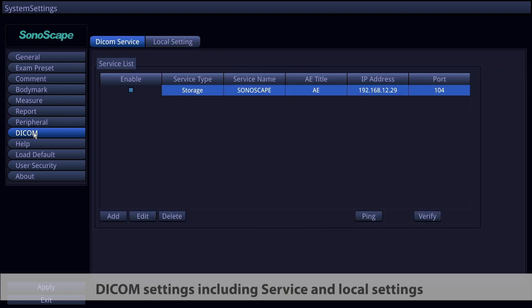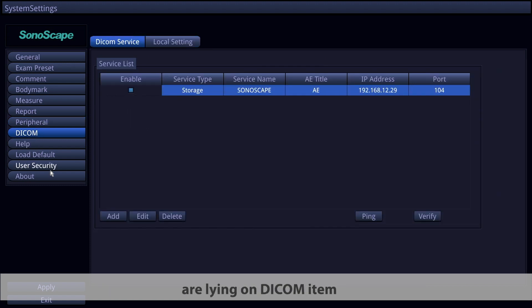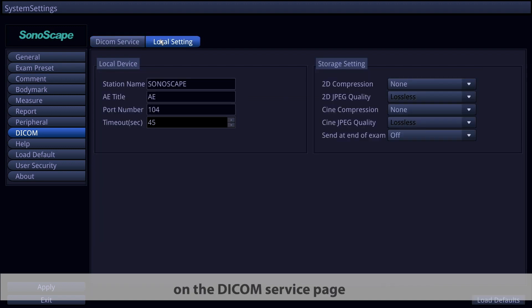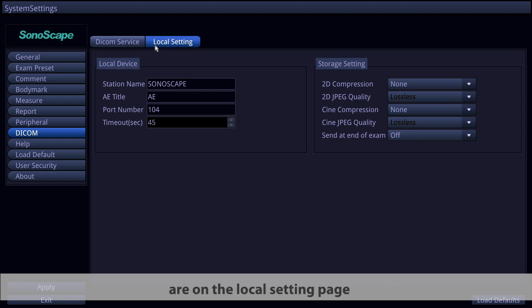DICOM settings, including service and local settings, are in the DICOM item. On the DICOM Service page, you can add, edit, delete, ping, and verify DICOM services. Local device and storage settings are on the Local Settings page.